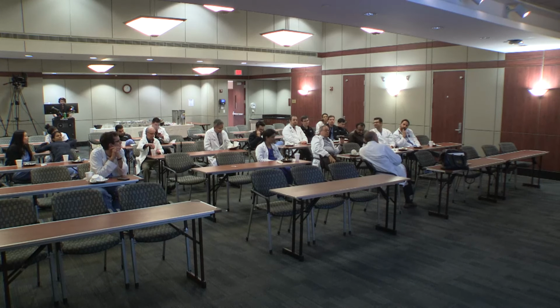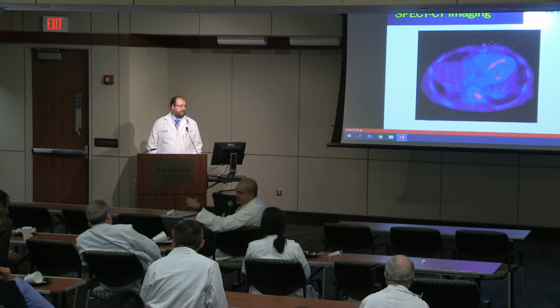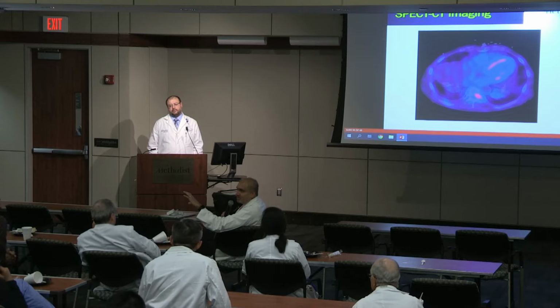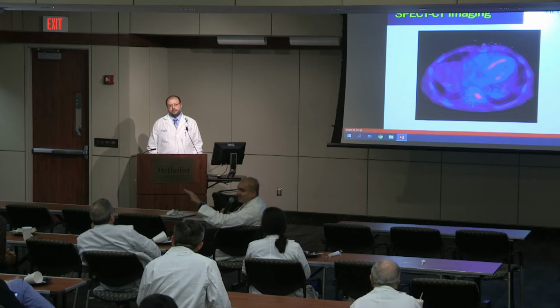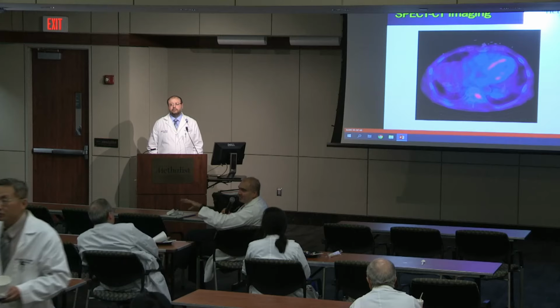No, so that's a very good question. I think that the slide that I showed was kind of a concept slide of what the ECV and T1 values do with different disease states or different conditions. And there's not a lot of data on this. There is some data. There was one research letter in the European Heart Journal that looked at it in athletes. In most athletes, the ECV values are actually lower than the normal values. And the reason is because they have mainly hypertrophy of the myocyte without really a lot of extracellular space expansion.